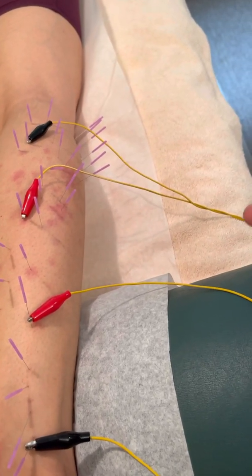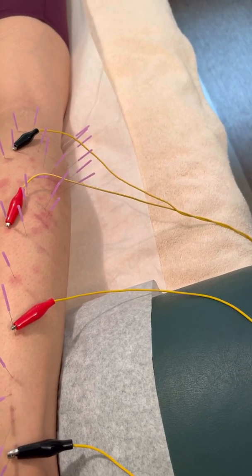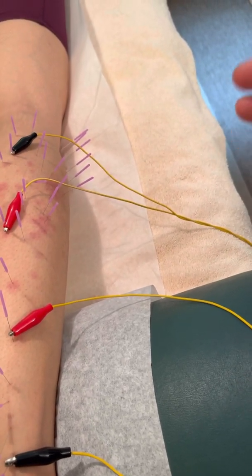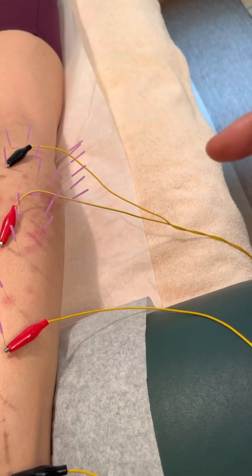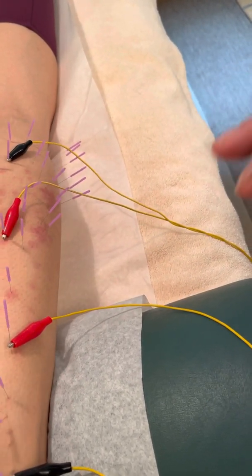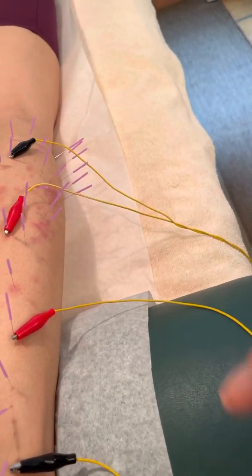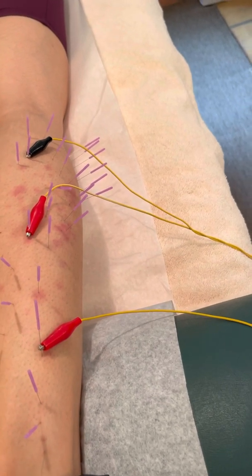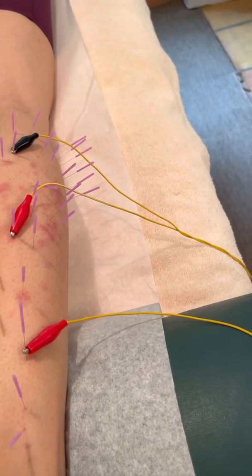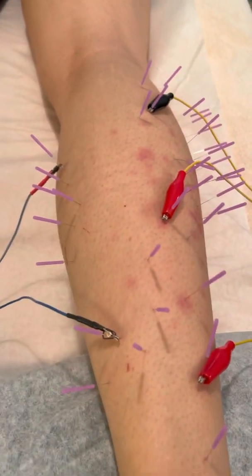This is patient-centered treatment, so you have to listen to your patient, unless they're asking you to do something that you know is not going to be helpful. Sometimes people do want it so strong, and I know that you'll be too sore later, but you just don't know. Are you rotating your leg like that? Yeah, okay. But in this case, she knows her body really well. She's a dancer and she's had this before. So I'm listening to what she's asking me to do. If she wants it stronger, there's no reason for me not to make it stronger.